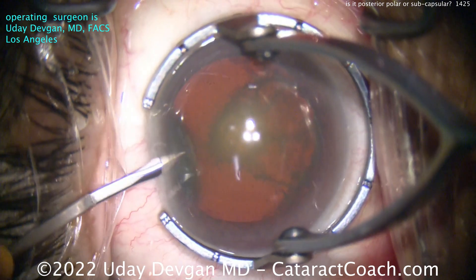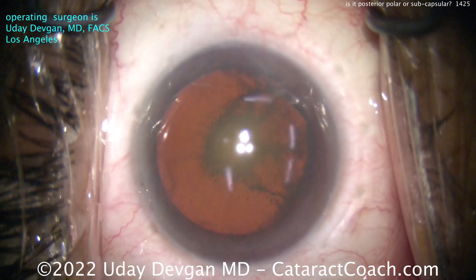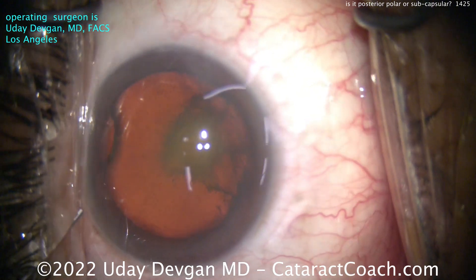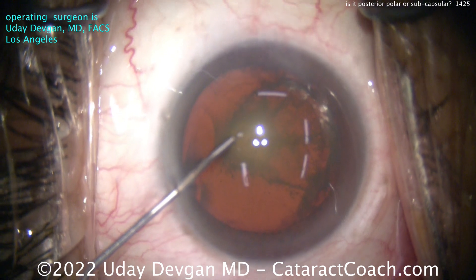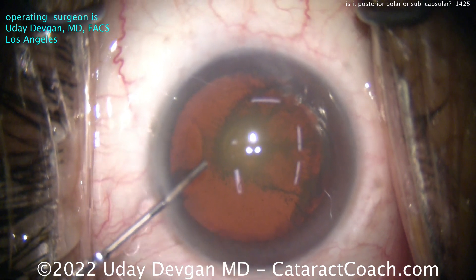This is me operating. I'm going to do a complete cataract case — first incision to the end of the case. I'm going to show you the whole case, so if you don't have 7 minutes to spare, don't watch it.